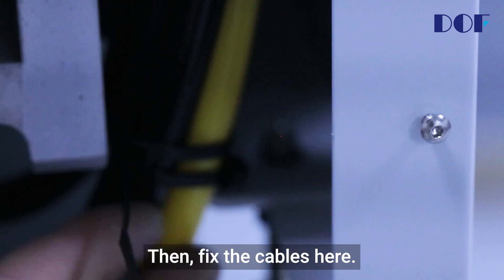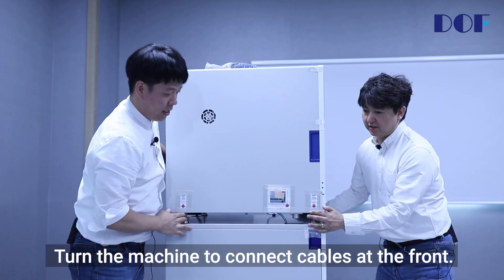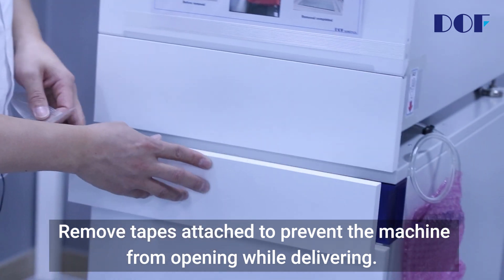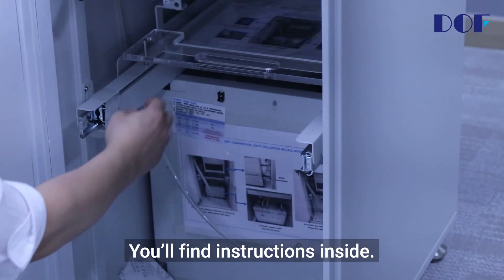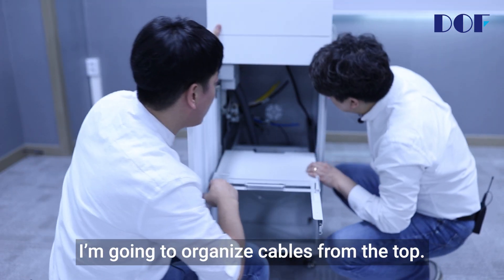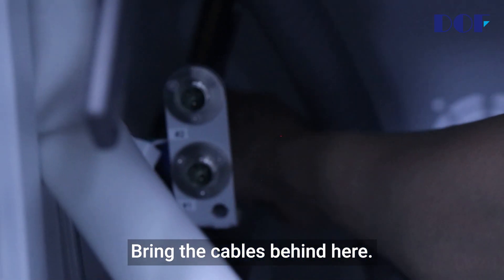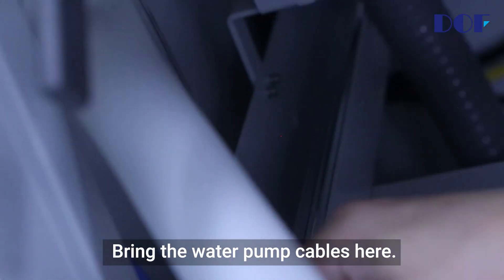Then fix the cables here. Organizing cables at the back is over. Turn the machine to connect cables at the front. Remove tapes attached to prevent the machine from opening while delivering. You'll find instructions inside — remove the instructions. I'm going to organize cables from the top. Drop the compressor cables to the bottom. Bring the cables behind here. Bring the water pump cables here. Tie the cables.